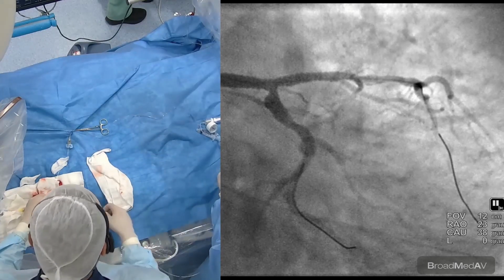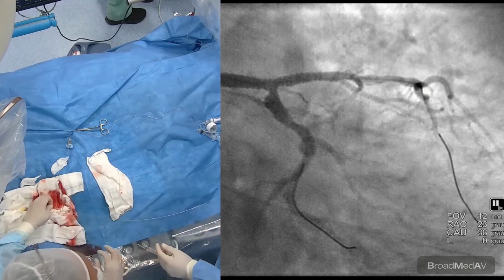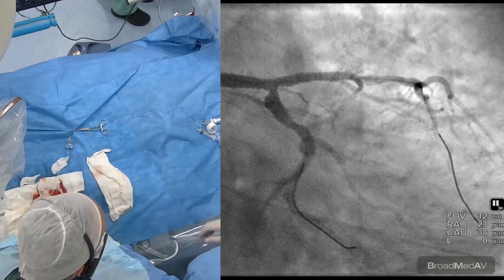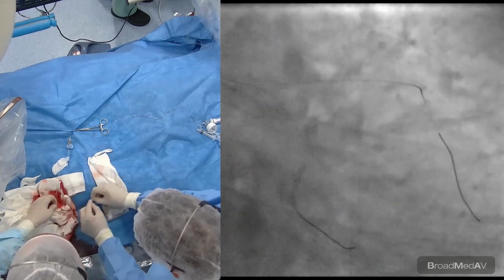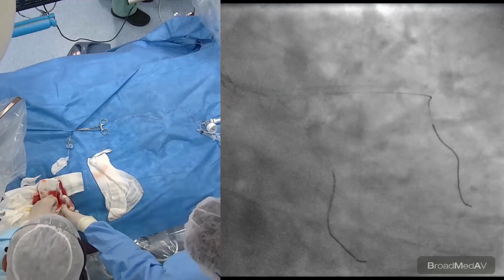A 3.5 by 20 balloon to post-dilate, please. 3.5 by 20 to post-dilate. Okay. And then we target here the distal portion of the vessel. Take your time. We still have time. And then we're going to go with a proximal optimization with a larger balloon.